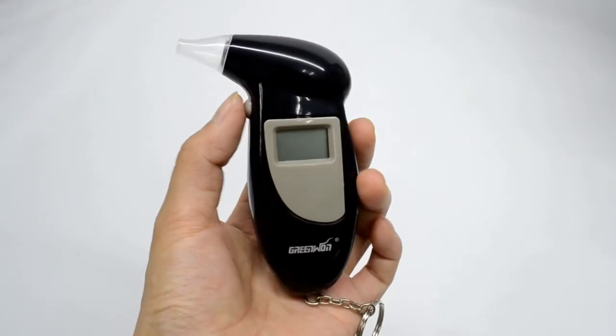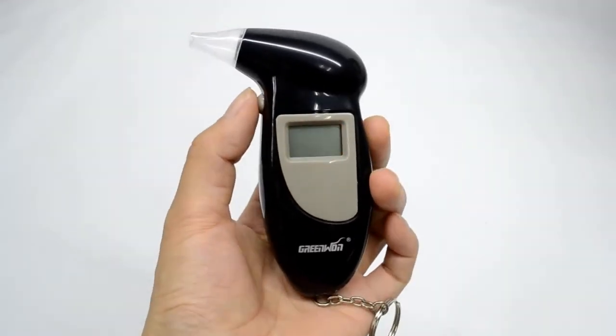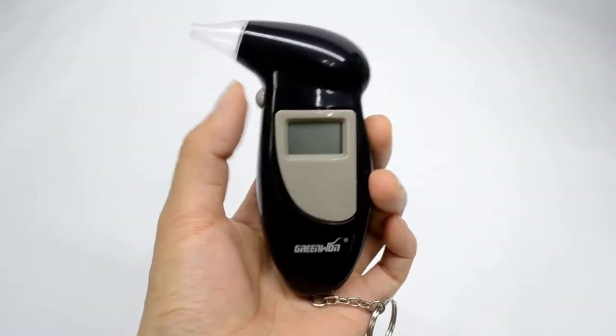Low power without digital display indicates you to replace the batteries before retesting.